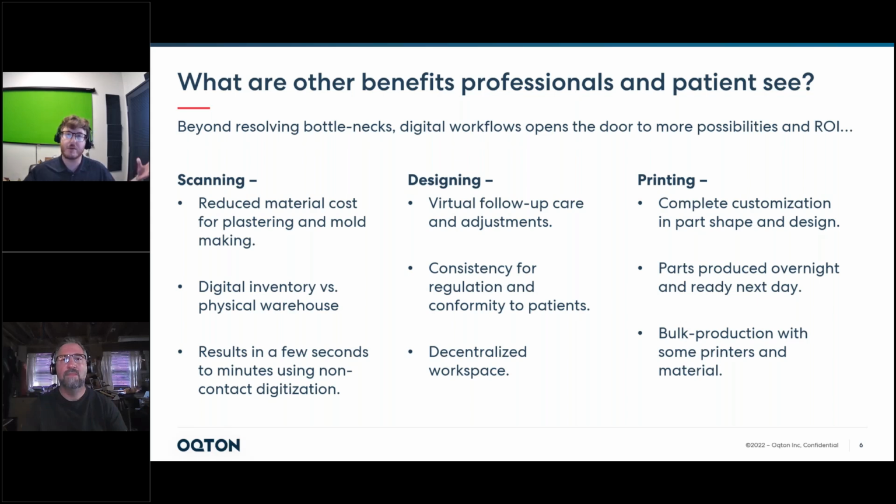So all these three together, again, they fit into different realms, different bottlenecks that cause a patient or a professional to want to move into this digital workflow. And they fit into different needs. And it's, again, not completely encompassing. It fits into specific spots that you can focus on and resolve first.